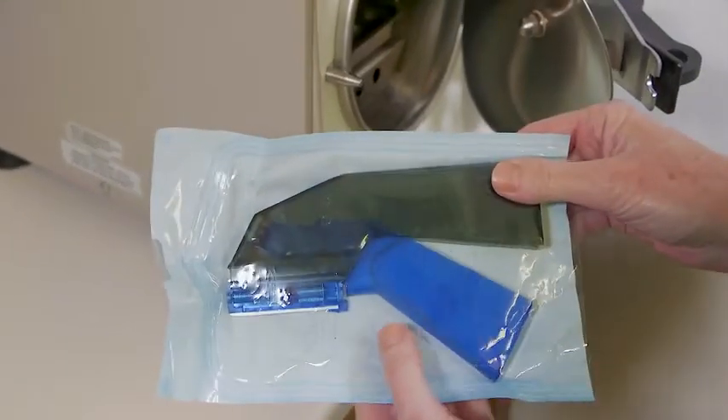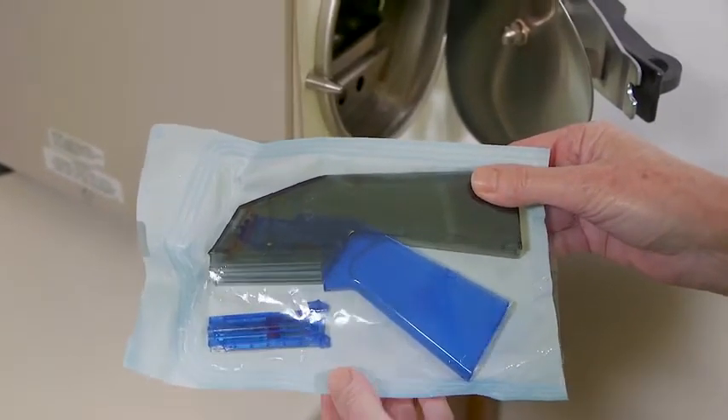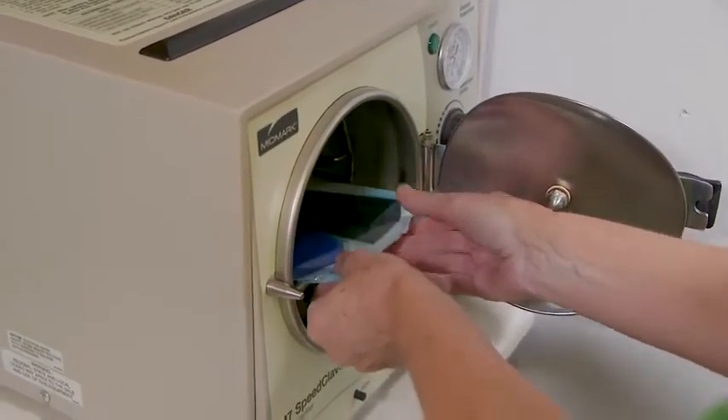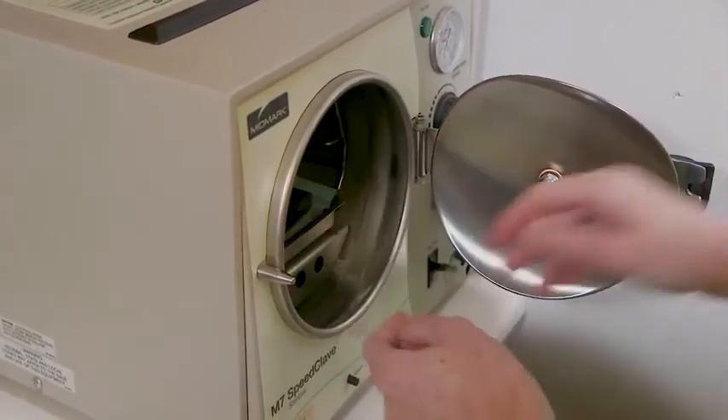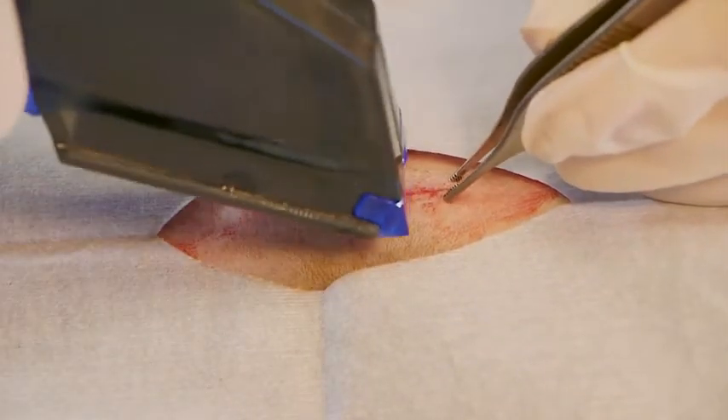Both the handle and the staple cartridge are warranted to be autoclaved up to 20 times, resulting in less waste. The autoclavable feature makes the cost of this stapler considerably less than suture material and other staplers on the market.